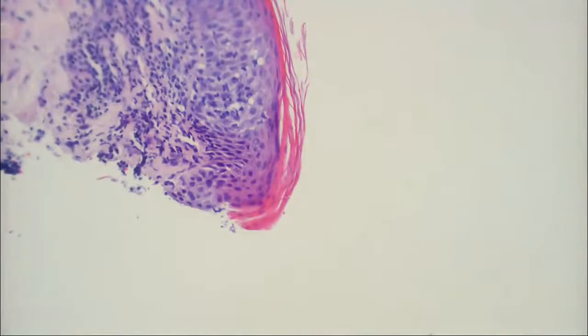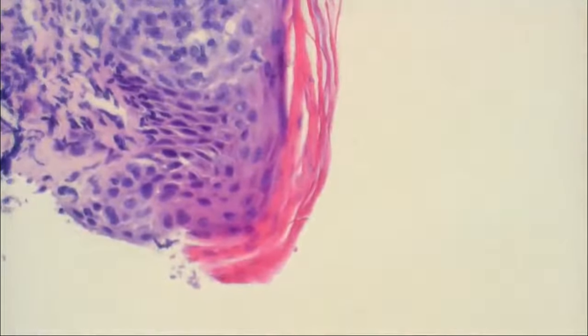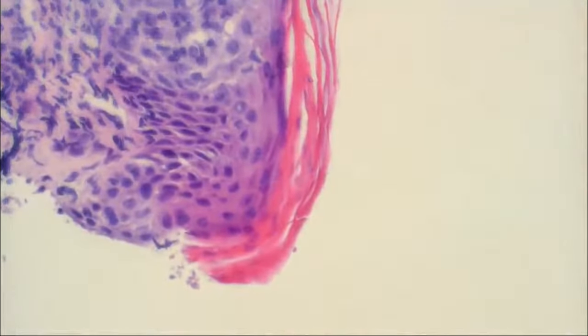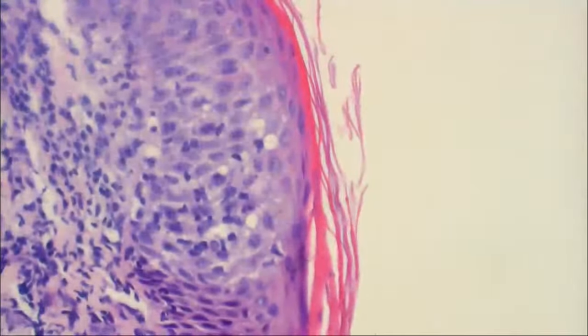I'm not sure if I'm seeing some sort of life forms. Life forms, yes. What kind of life forms? Like alien life forms, or fortunately it looks like terrestrial fungi. Terrestrial fungi? Good. So what's the diagnosis? Tinea. Very, very good.